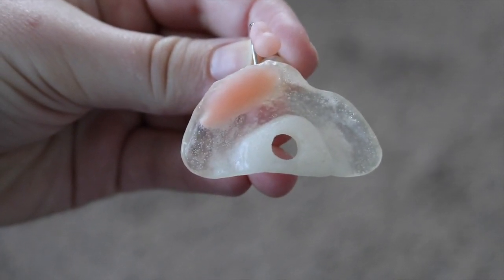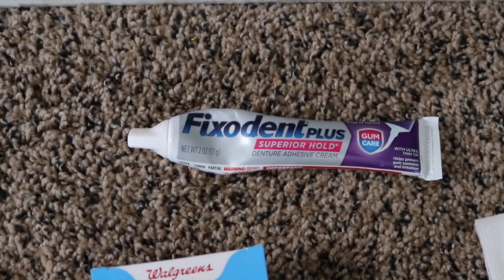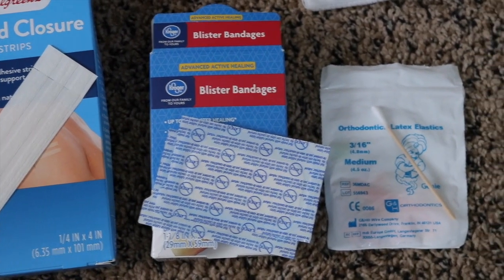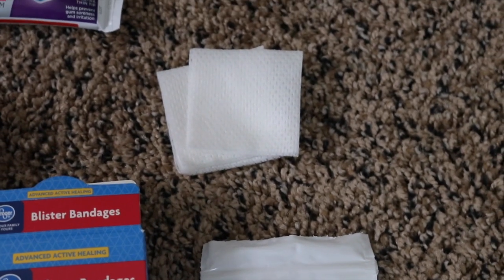Now we're going to show you how to put the NAM in. These are the supplies we use: we have some Fixodent, which is a denture glue, some wound closure strips, blister bandages, some little elastic bands that you usually get with braces, along with a q-tip in case we need it, and some gauze.